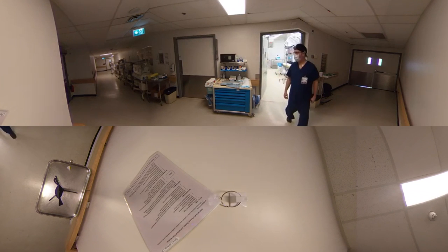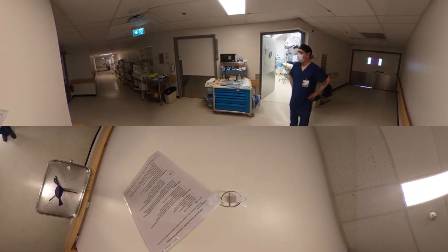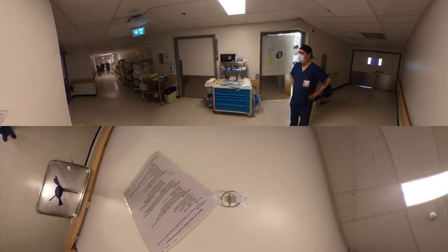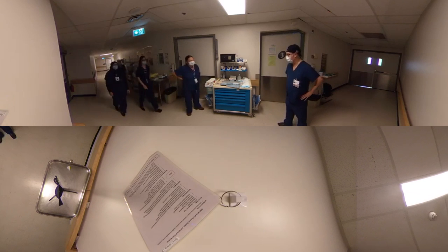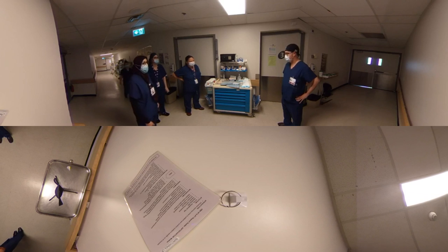Code 333, Labour and Delivery, Salle d'accouchement. Thanks for coming. A 30-year-old woman, known COVID-19 positive, was in the community self-isolating, was fine, but just came into triage right now — 34 weeks, ruptured membranes and cord prolapse.